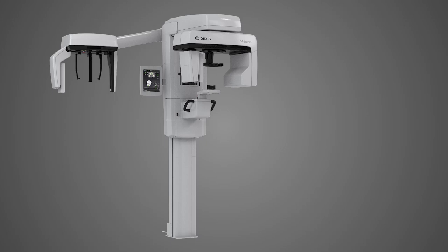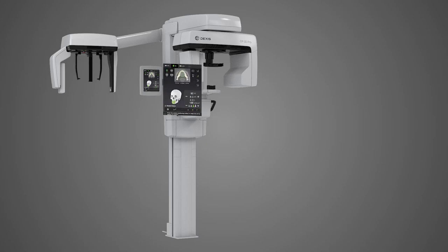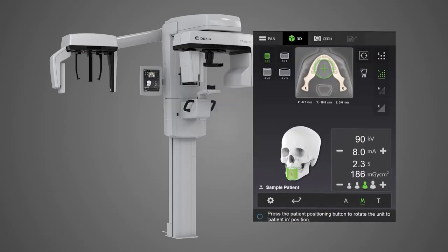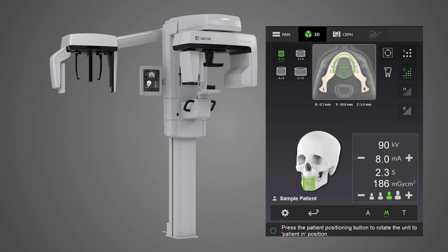Once the patient is selected in your imaging software, use the unit's touch screen and select the 3D tab. Select the appropriate field of view. The system offers a variety of scan sizes and resolutions to minimize patient exposure relative to the detail required for the patient's particular need. The available field of view options and scan sizes are based upon the sensor panel size of your unit.